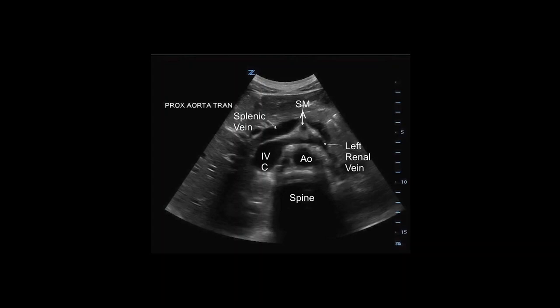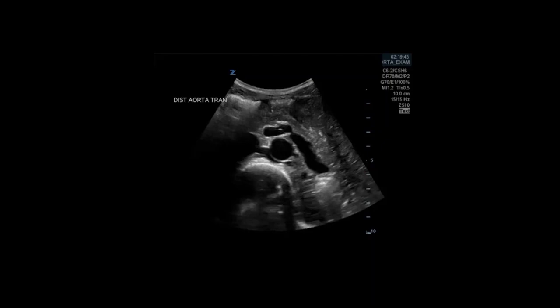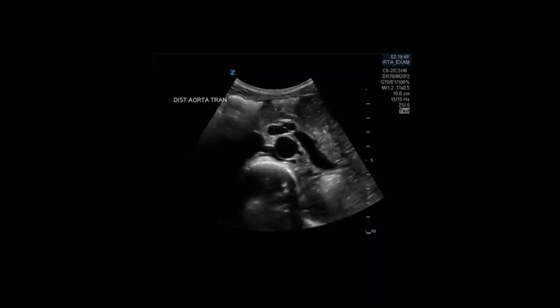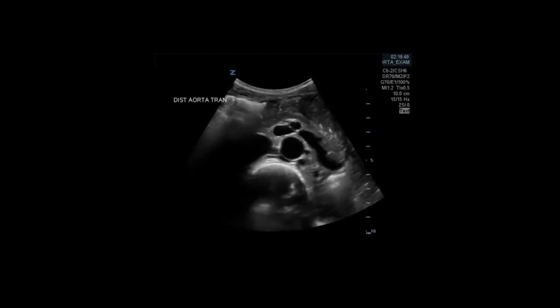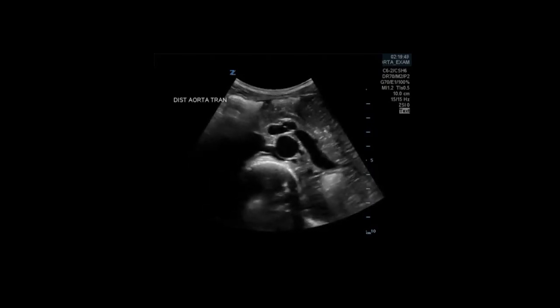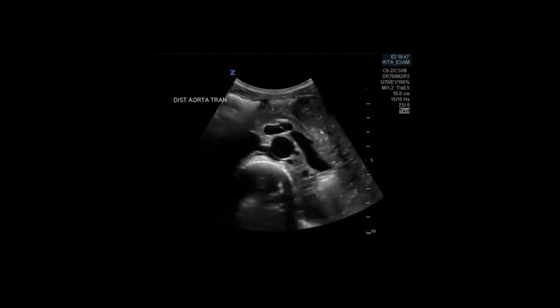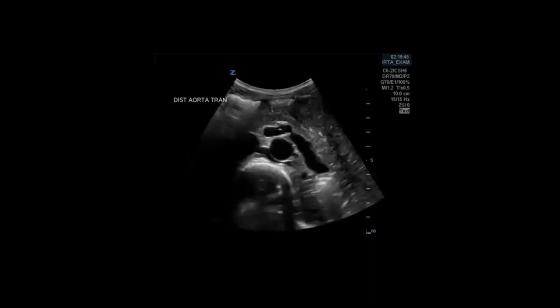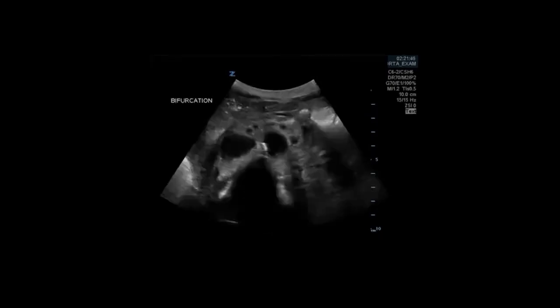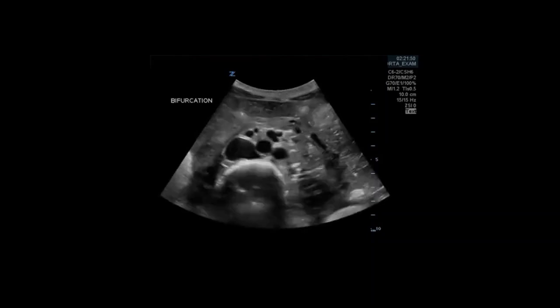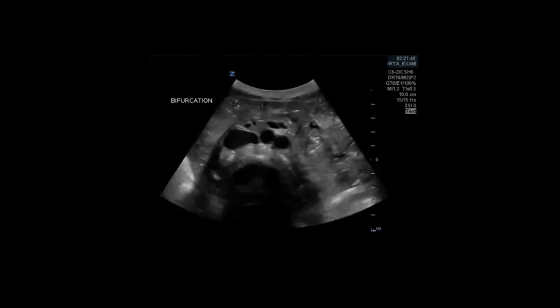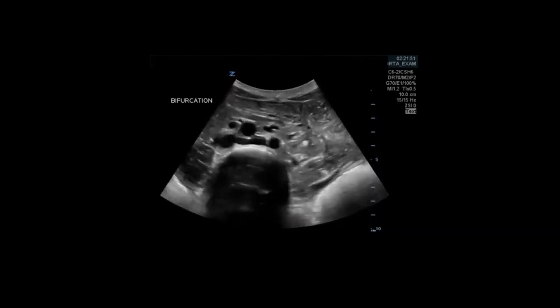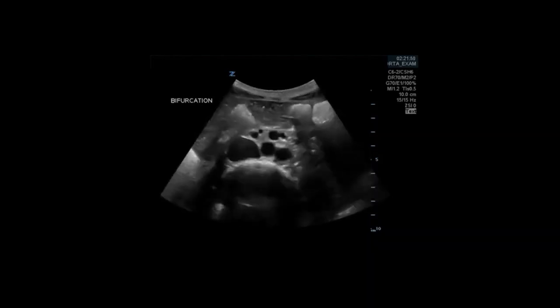This is the most common anatomical arrangement; there are some normal variations that are not imaged here. Next, slide your probe inferiorly, visualizing the entire aorta in the transverse plane. Note that the aorta becomes more superficial as you move inferiorly, so your depth may need to be adjusted accordingly. You can see the aorta continues to run anterior to the vertebral bodies of the spine. As we reach the level of the umbilicus, you will see the aortic bifurcation into the iliac arteries. As the umbilicus is filled with air, you may need to move superior or inferior and then fan up and down to visualize the bifurcation, which is demonstrated here.